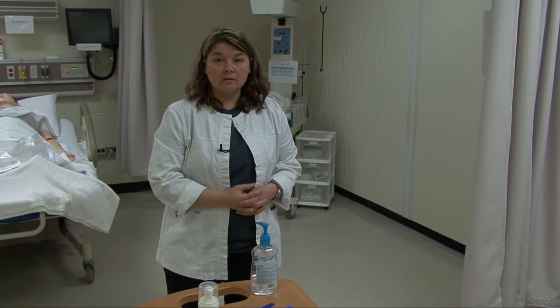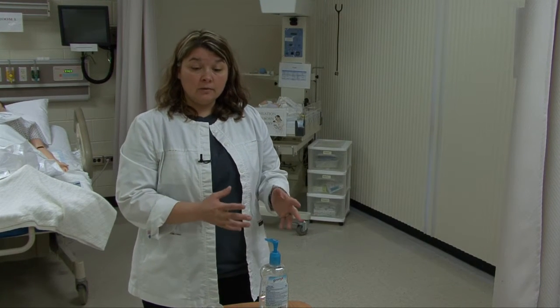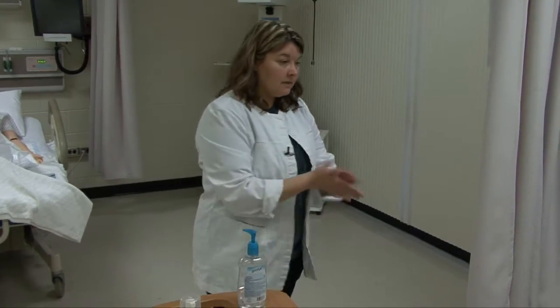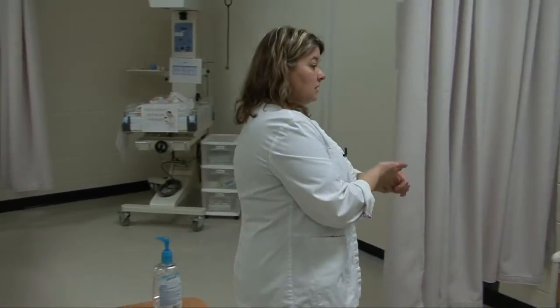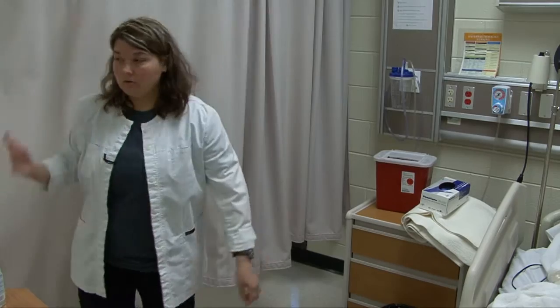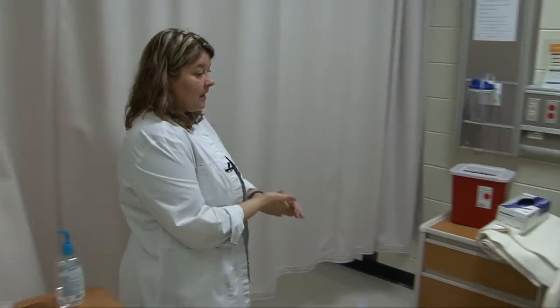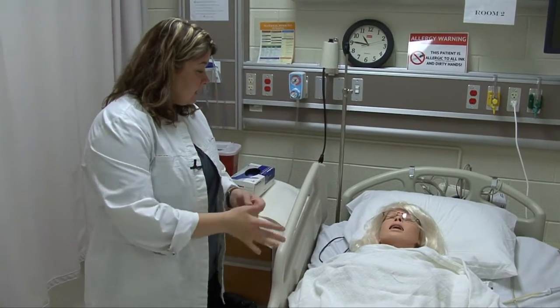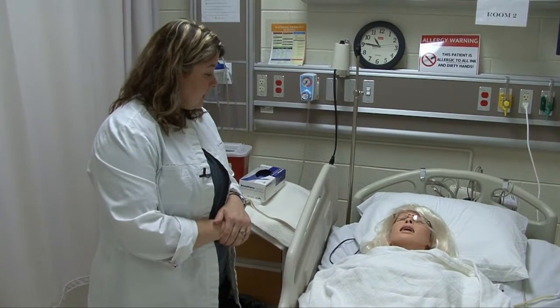Good morning. My name is Heather Cox, and this morning I'm going to talk to you about how to discontinue a urinary retention catheter. I'm going to enter the patient's room — I would knock and come in as I entered. Good morning, Ms. Smith. My name is Heather. I'm going to be your nurse. I'm going to pull the curtain and provide for privacy. I'm coming in so I can discontinue the catheter.